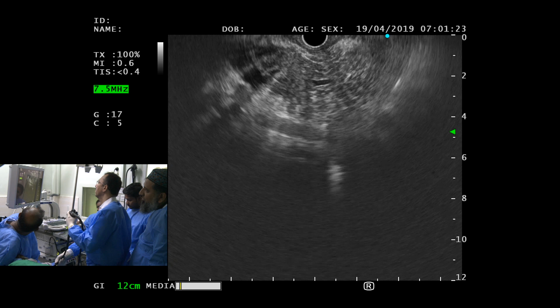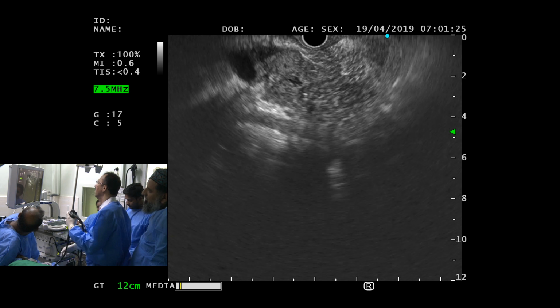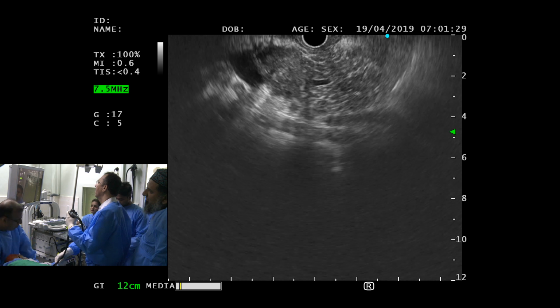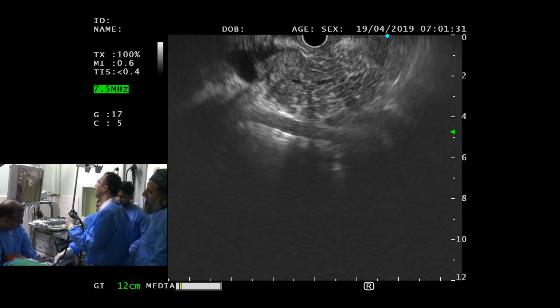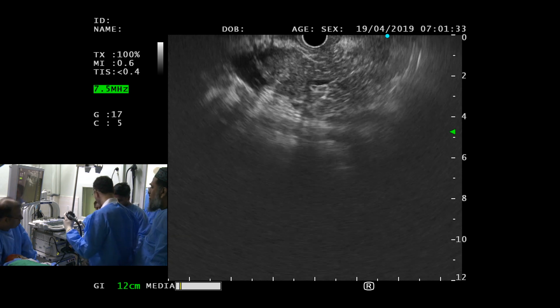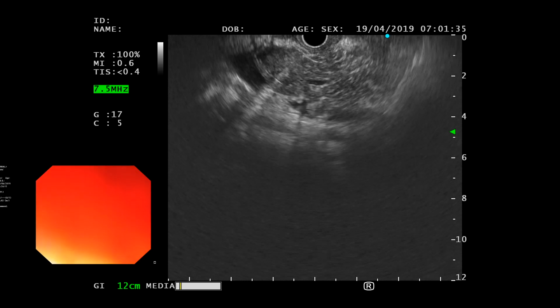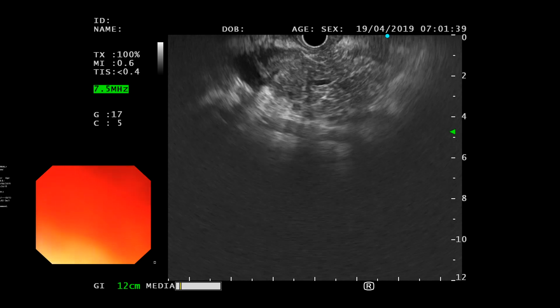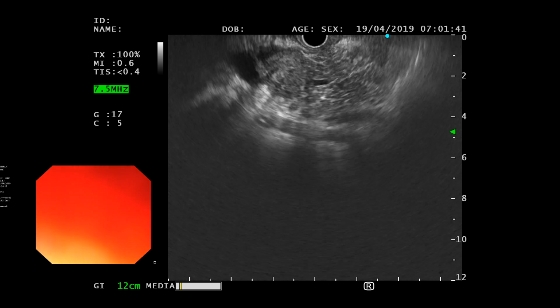नहीं ये नहीं है, ये वो है भी नहीं ना. जो मैं दिखाना चाह रही हूँ, ये वो है ही नहीं. वो तो PD के अंदर आ रहा है. ये तो हेड पोजीशन. Let's proceed with the FNA. America says proceed. Pakistan says don't proceed.